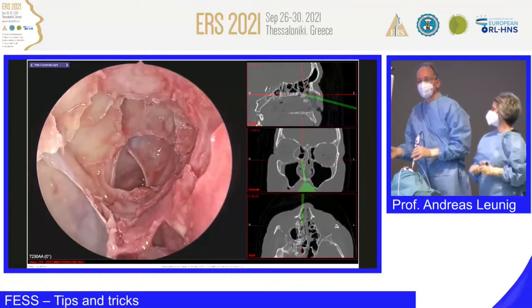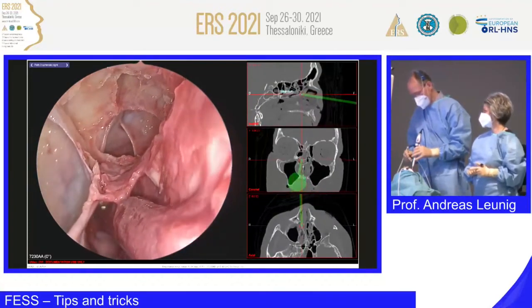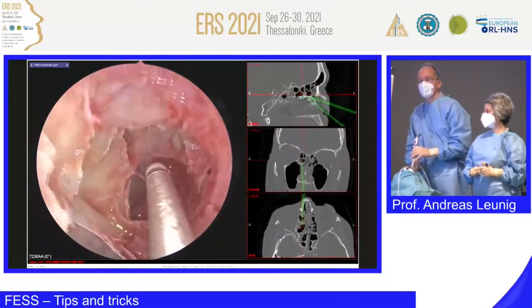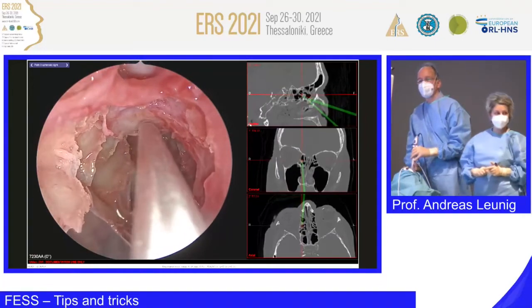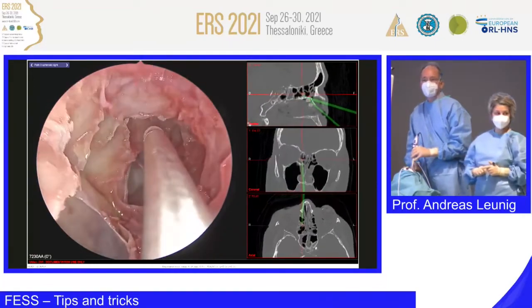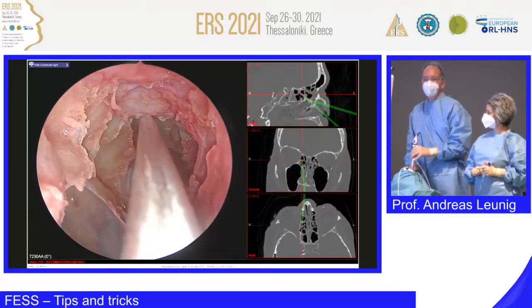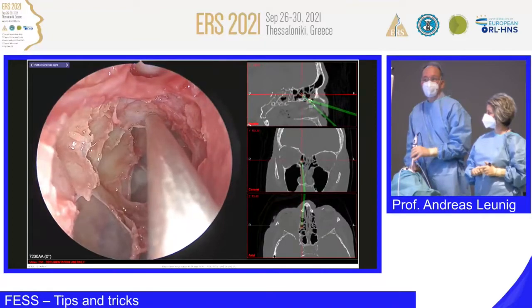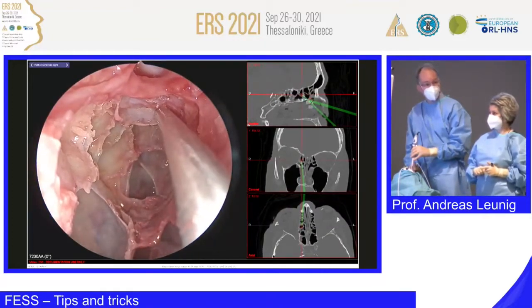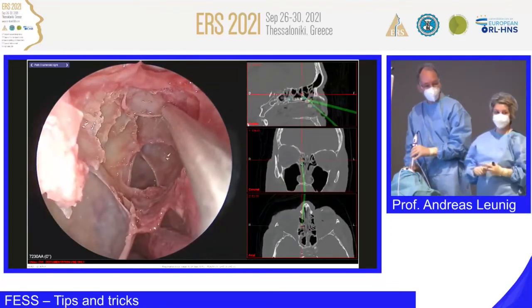What do you think? Give me the pointer. I show you the anatomy. Thank you. What do you think? Where's dura? Do you mean this here? This one. Yes. This dura. Here. This is a dura. No, that's not dura. No, this is. For sure, this is dura. This is dura? Yes. When you look at the navigation, it's not dura, there's a cell behind, but thanks very much. It's a good comment, because you never know, definitely, you never know.